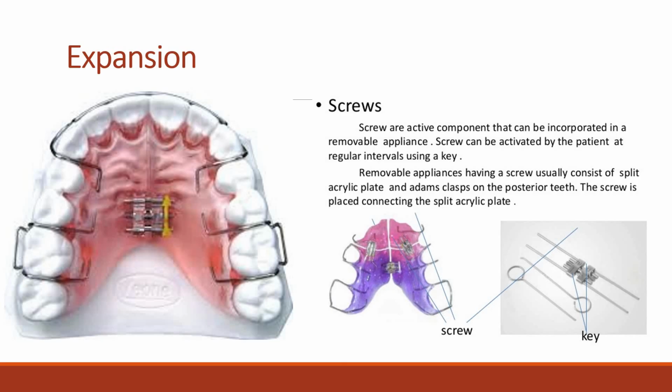Comprehensive orthodontic treatment is no longer undertaken with removable appliances alone because the results are invariably inferior to those produced by fixed appliances. However, removable appliances are relatively simple to use, generally well tolerated by patients, and can be used very effectively to correct minor occlusal problems, such as crossbites, in the mixed dentition, or provide a valuable adjunct to fixed appliance therapy.